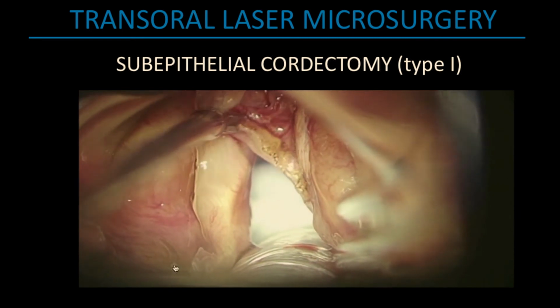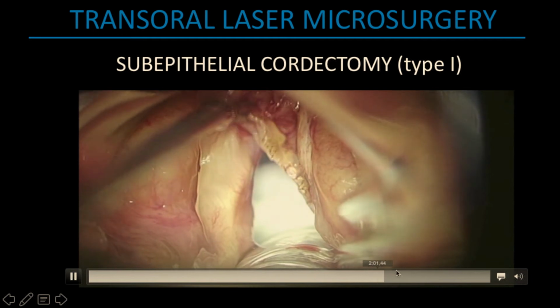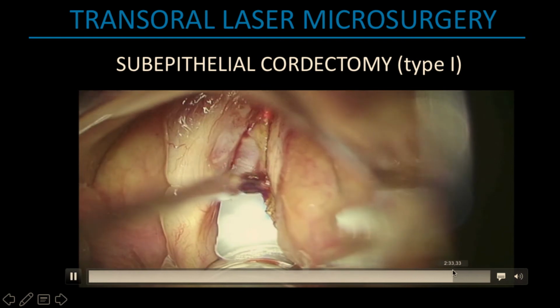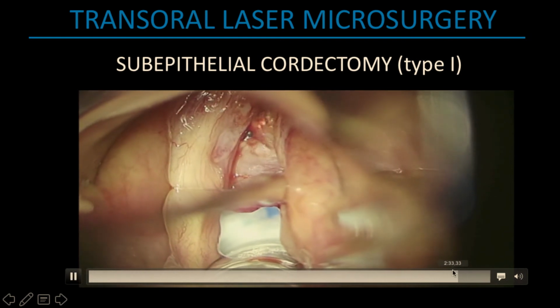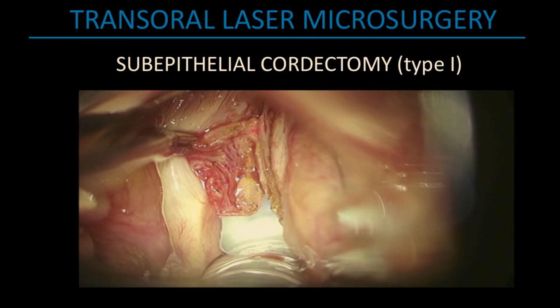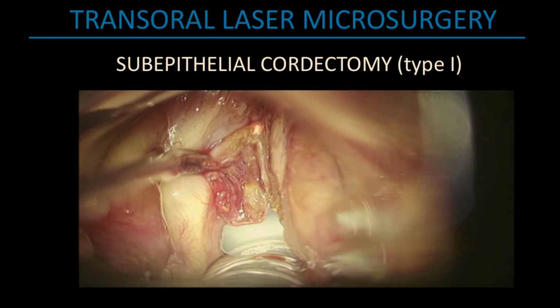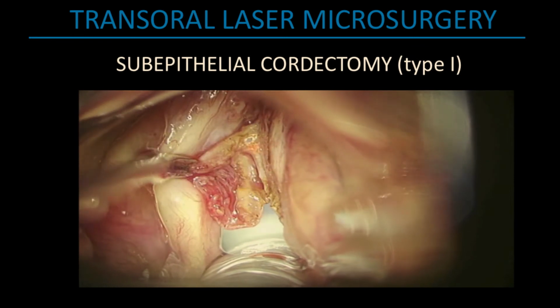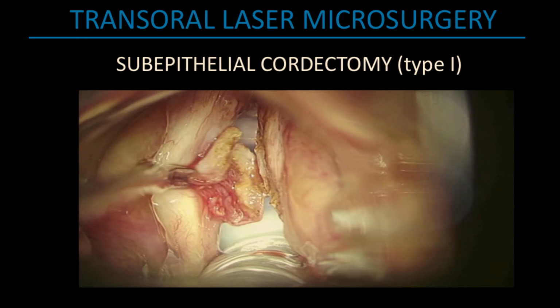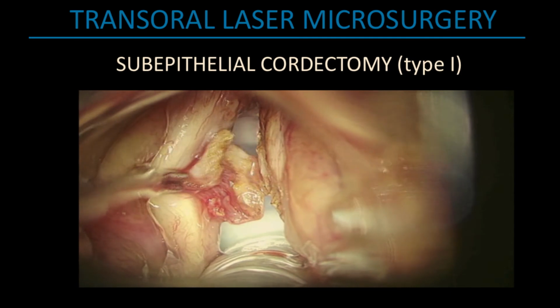This is a less invasive chordectomy that you can perform. I go a little faster. It's very important to well-orient the specimen, maybe to mark the specimen with some ink, and to have a very close collaboration with the pathology. You have to invite the pathology in OR to decide with him what is the best way to send the specimen.